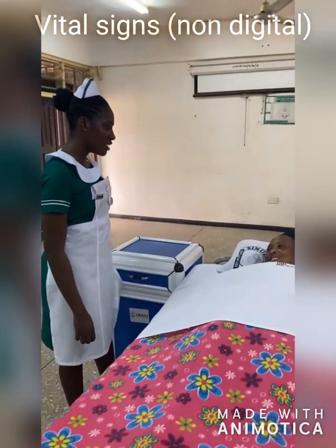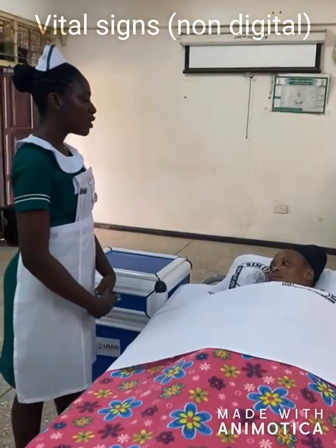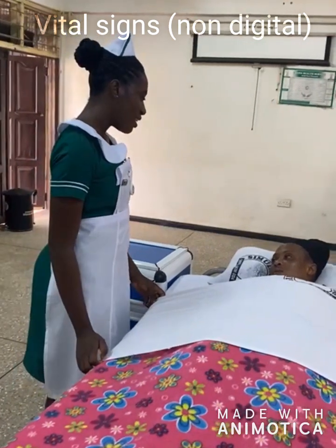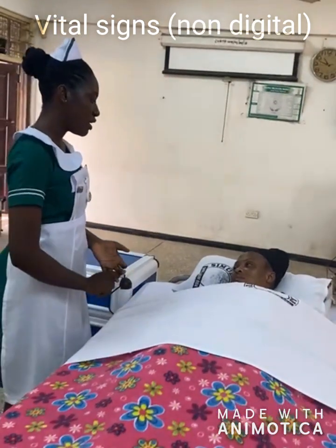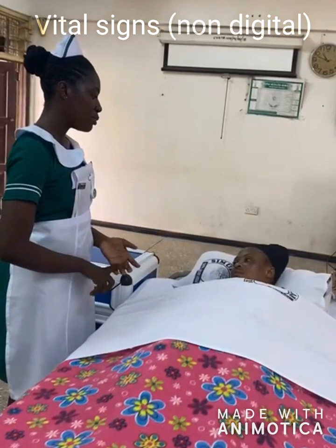Good morning, Sister Bende. How are you doing? This morning I'm here to check your vital signs. Am I allowed to do this? Thank you. So the vital signs I'll be checking for are your temperature, your blood pressure, your pulse, and respiration.